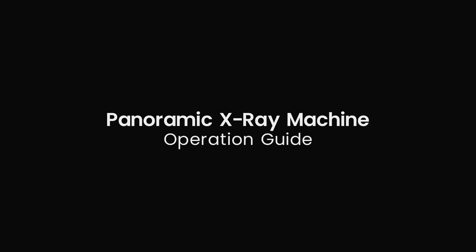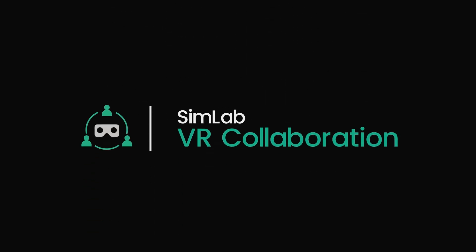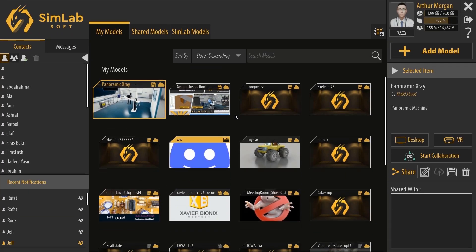Hello everyone. Today I am going to demonstrate the operation of a dental panoramic x-ray machine to some trainees in VR using SimLab VR Collaboration, and I will walk you through all the steps that you need to follow to start a collaboration session of your own. In SimLab VR Viewer, after adding the x-ray VR experience, I'm going to select it, then click the VR Collaboration button.